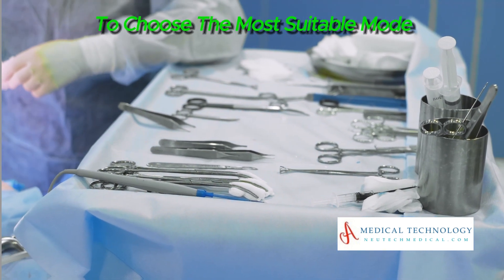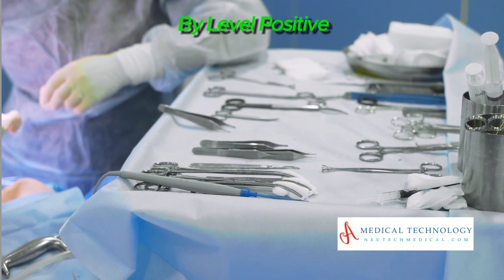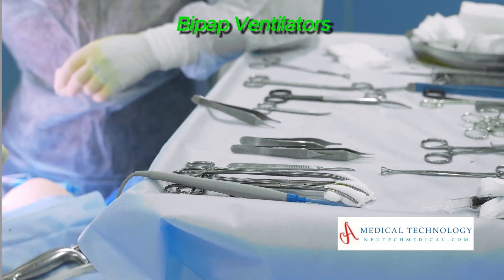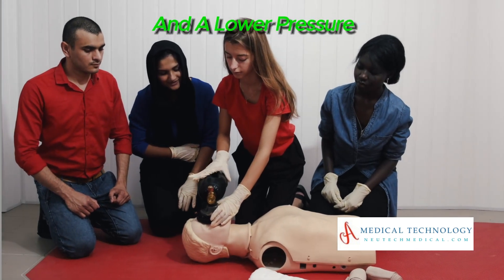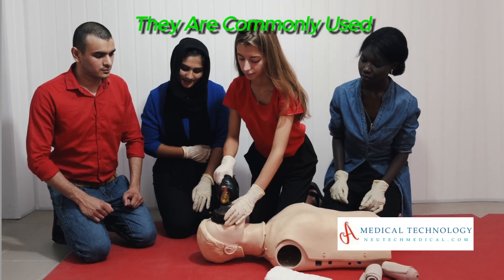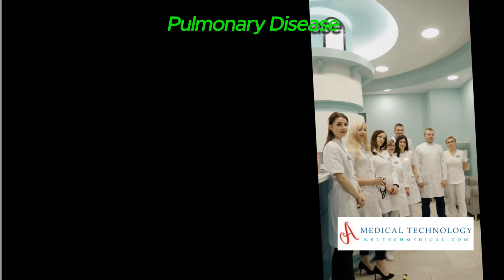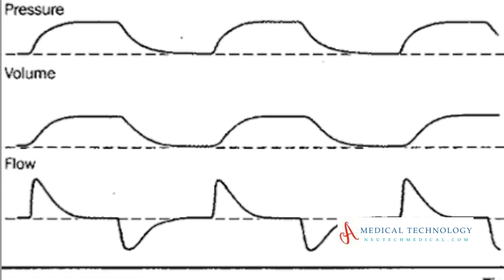BiPAP (bilevel positive airway pressure) ventilators provide two levels of positive airway pressure — one during inhalation and a lower pressure during exhalation. They are commonly used in non-invasive ventilation for conditions like sleep apnea or chronic obstructive pulmonary disease (COPD).